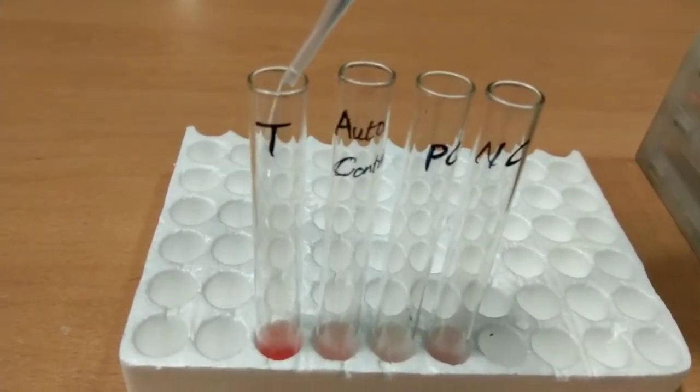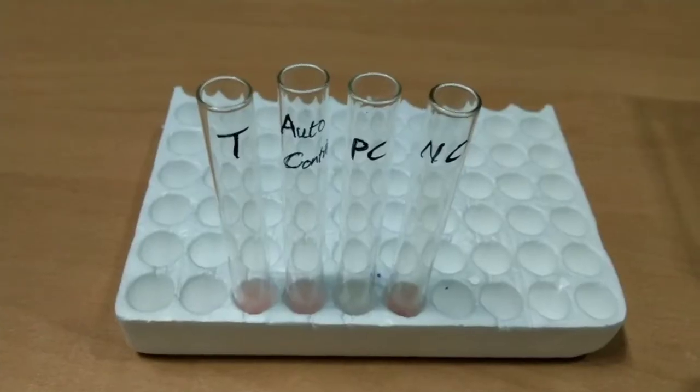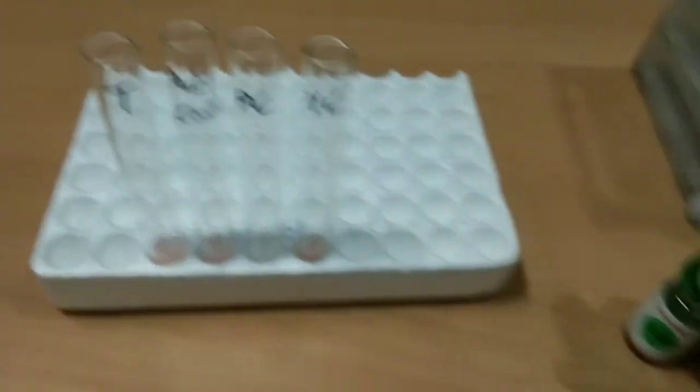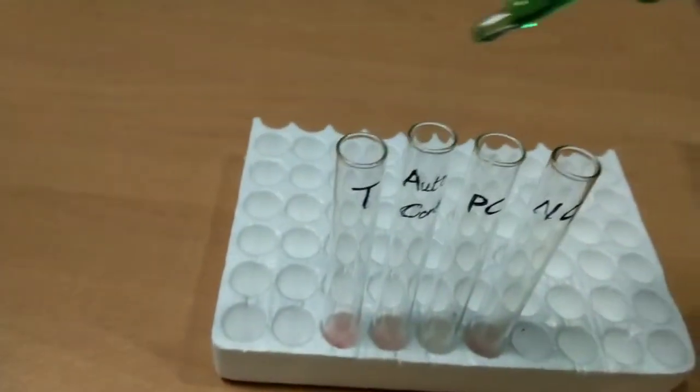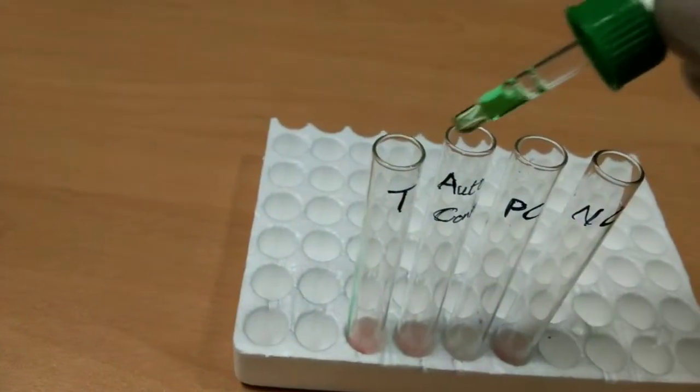Wash the cells three times with normal saline. After complete decanting of the final wash, add a drop of AHG into each tube.